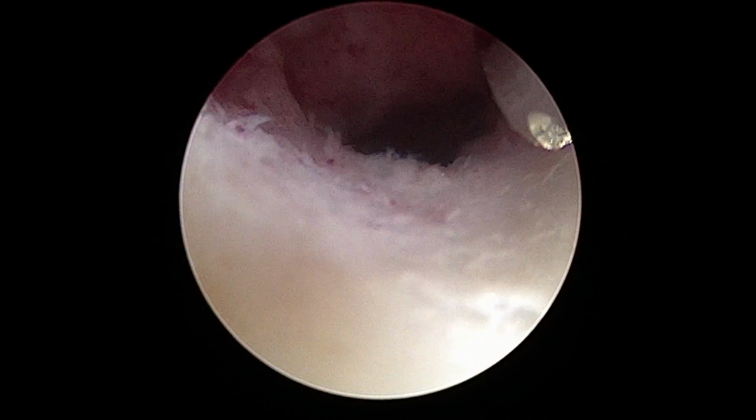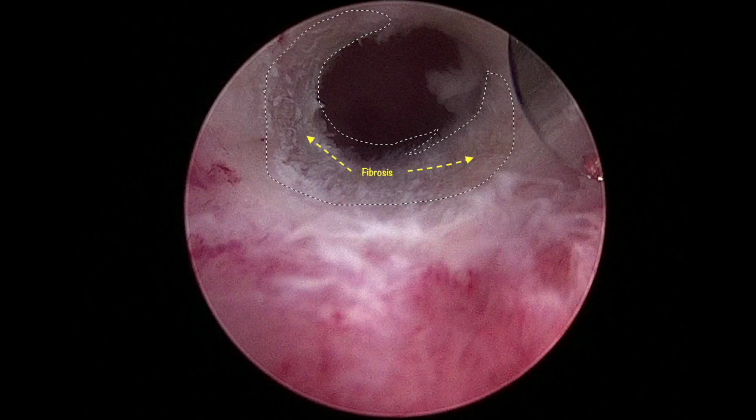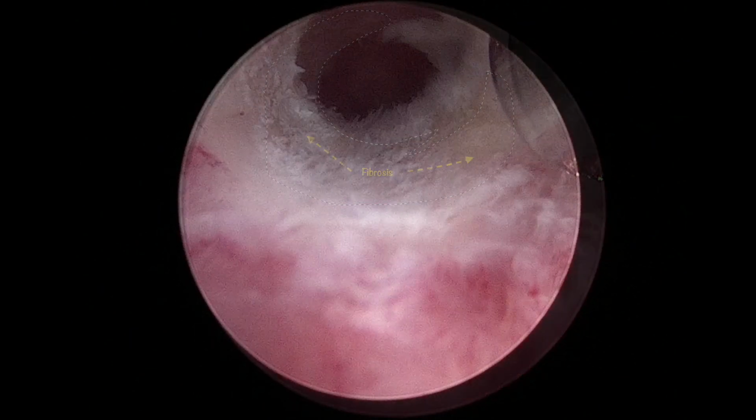And this is another technique to deal with the stenosis by using the tissue retrieval system in office with a visual analog score of 4.